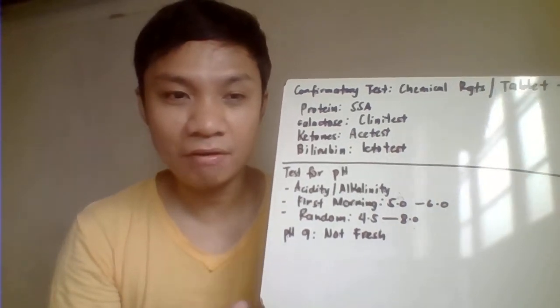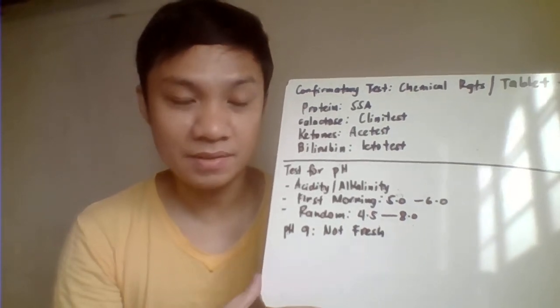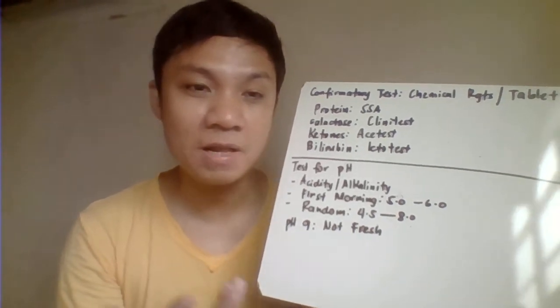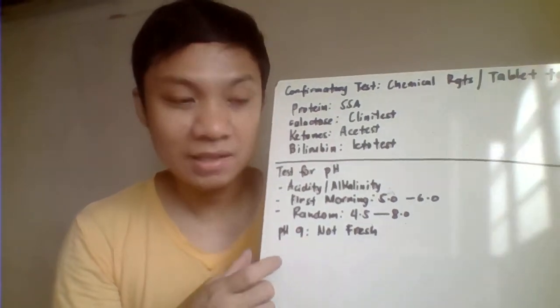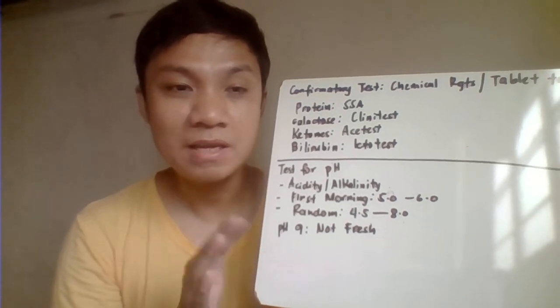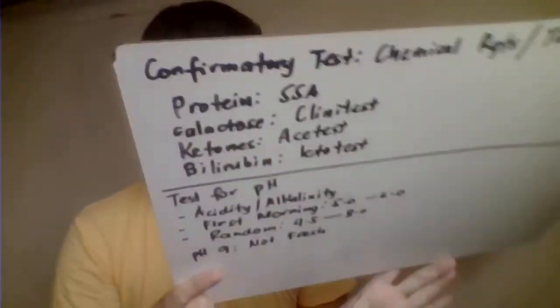Again, our cut-off dapat is that the specimen should be delivered to the laboratory within 2 hours of collection. More than that, magkakaroon ng bacterial multiplication, and we consider this an unsatisfactory specimen. This warrants the patient to be required to recollect, to have another fresh na specimen sample.